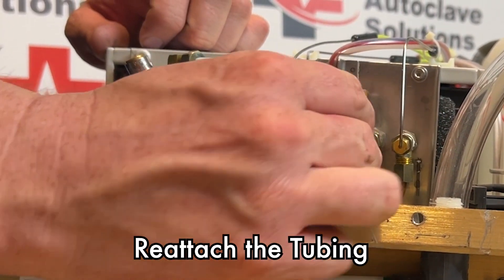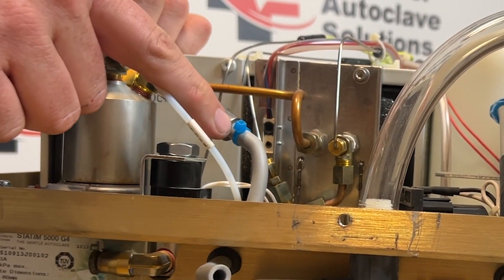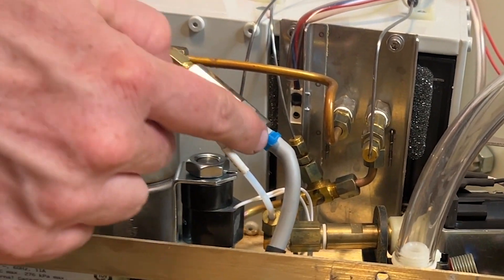We do want to reattach our tube to our check valve. The new check valve comes with a new zip tie. However, I did not change this check valve as it is brand new.